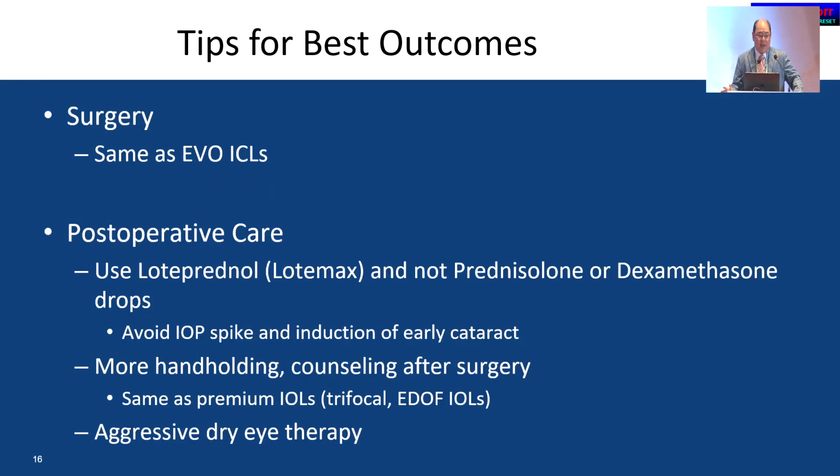The surgery, as I said, is the same as with EVO ICL. There's no difference in loading, implanting, and post-op care is the same. I use loteprednol instead of Pred Forte to avoid IOP spike.